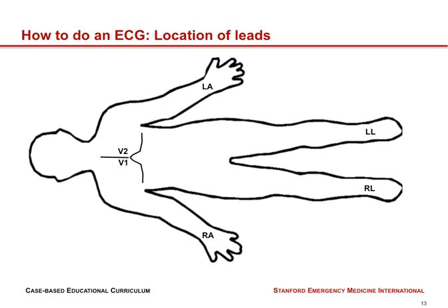V1, V2, V4, V3, V5, and V6 comprise the precordial leads that are on the chest. Notice that we mentioned V4 before V3 because typically the order in which you place these leads is V1, V2, V4, then V3 between V2 and V4, V5, and V6. The reason for this will be very clear in a moment.